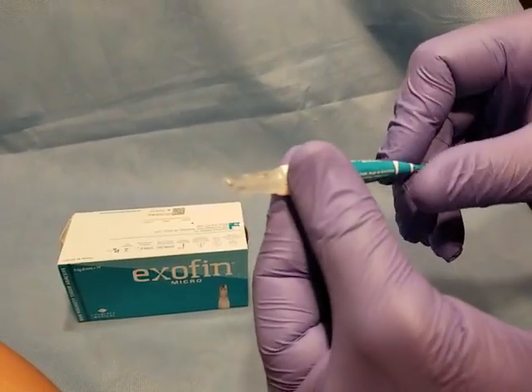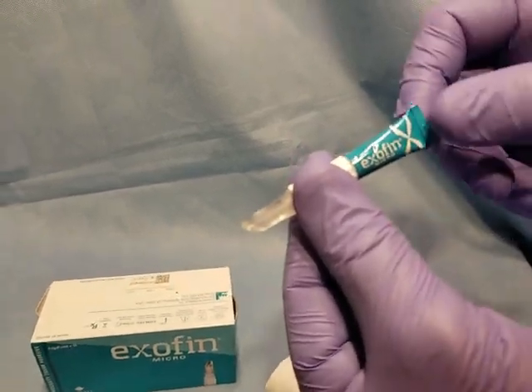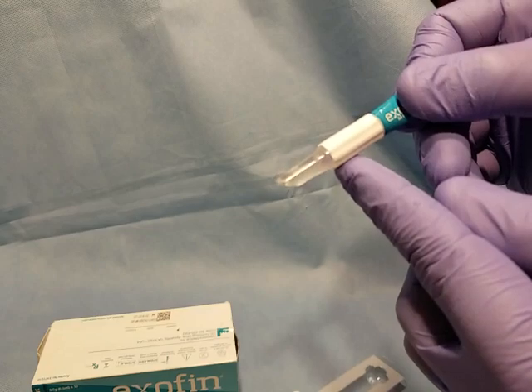Once you are ready, you're going to hold the white part, screw it all the way down, hold it down at about a 45 degree angle. There's a large X at the back of the tube — gently squeeze that X until you start to see the purple glue come out.